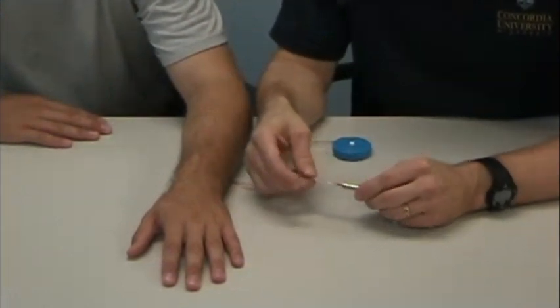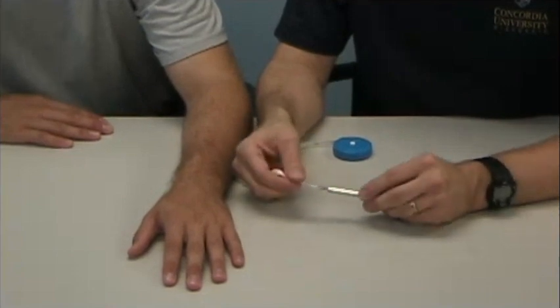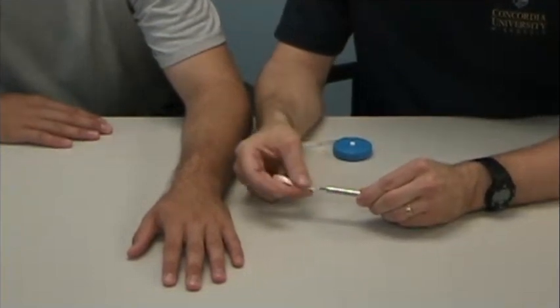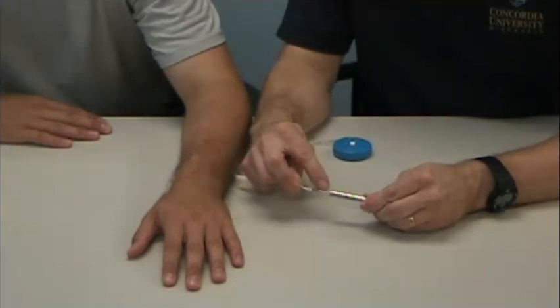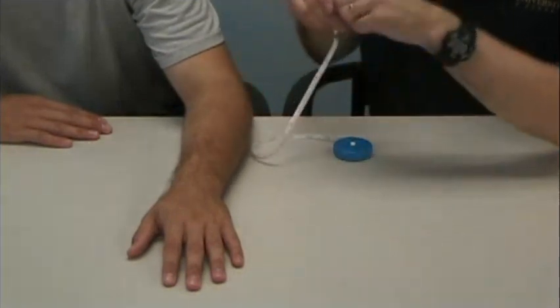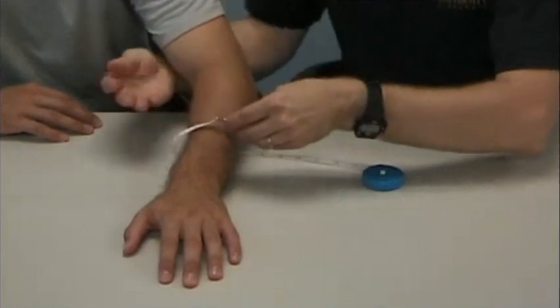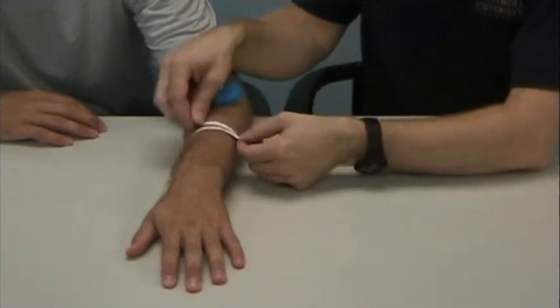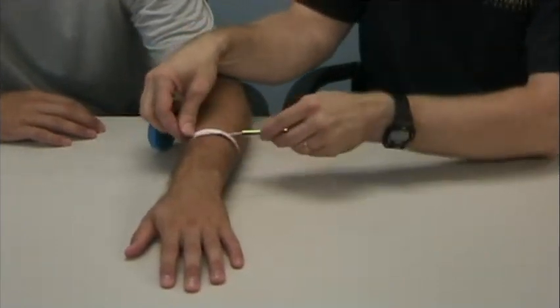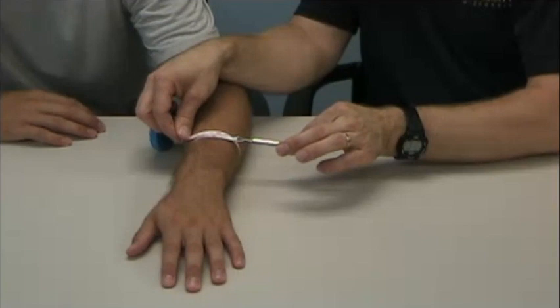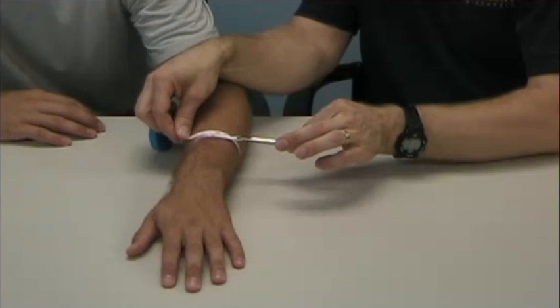This is that Gulick measuring tape that has the device at the end that's spring-loaded. As you pull and put tension on the tape, you can see the hook that's holding the tape comes out of the cylinder. At some point, right about here, there's a little mark on that. I don't know if you can see that on the video or not, but there's a little mark there. With this one, if you're trying to measure your circumference, you're going to line up the zero on the tape with whatever mark it lines up with. By pulling on this device and just pulling it out until you can just see that mark, that will provide a constant tension and improve the reliability somewhat of your circumferential measurements.